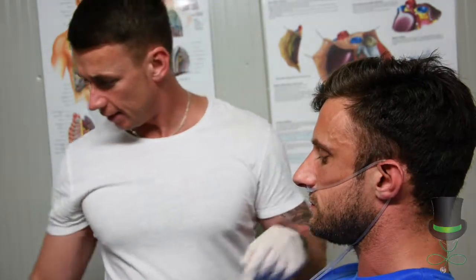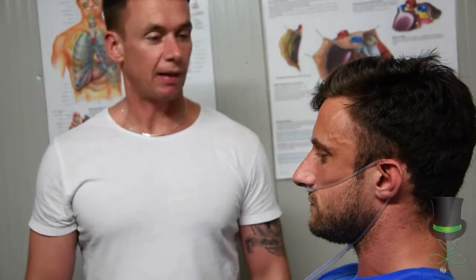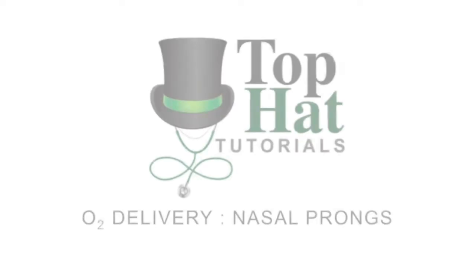We then set the correct flow rate on the oxygen bottle. Is that comfortable? Yes. Thanks.